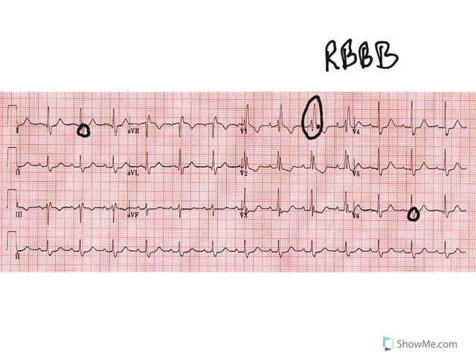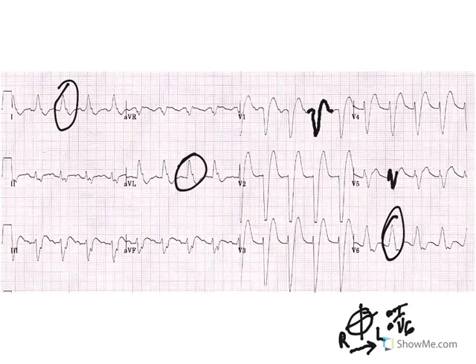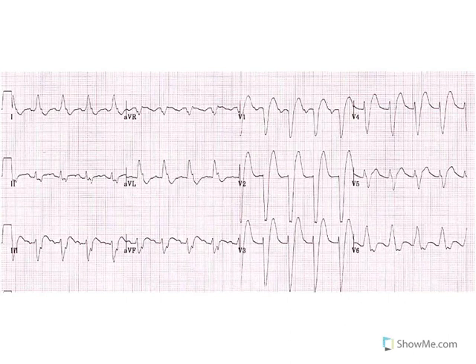All right, so let's talk very, very quickly about Sgarbossa's criteria. And I'm going to go back to left bundle branch block, because Sgarbossa's criteria is something we use for left bundle branch block, not really for right bundle branch block.